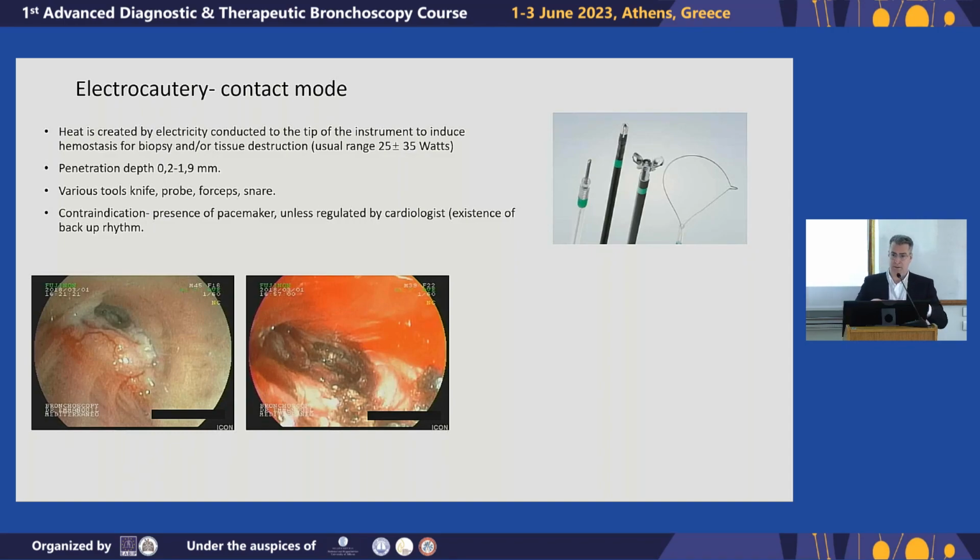We use this thing we put on the legs of the patient. It's the way for the electricity and the thermal energy to dissipate through the body. So it is, of course, always important to have the patient grounded, as we call it, but it's not actually grounding. It's a zero point where the heat and the electrical energy dissipates.